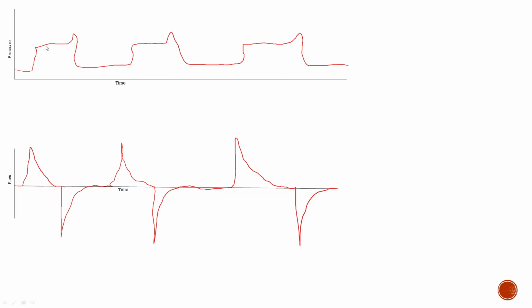So this is the patient at the end of inspiration actively expiring. And you can tell on the flow loop that it hits 0, and then you see this before, if you time these together, I should have put a line here, but if you time these together, before the inspiratory breath terminates, you see the patient take a deep, sharp, downward-going form of expiration before the inspiratory time is even over. And that's why you sense this positive deflection here. So this is active expiration. It's another form of desynchrony. On a pressure-controlled mode of ventilation, you can decrease the I-time, and it might help. It should help.